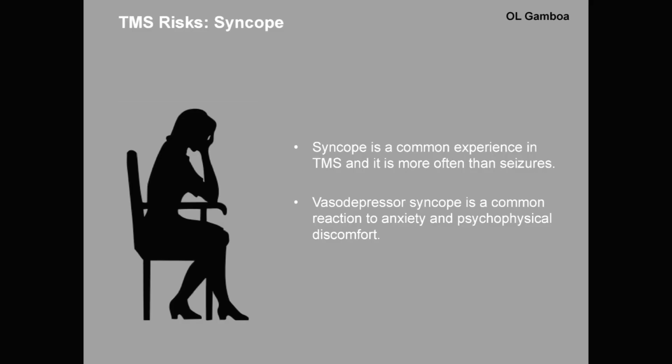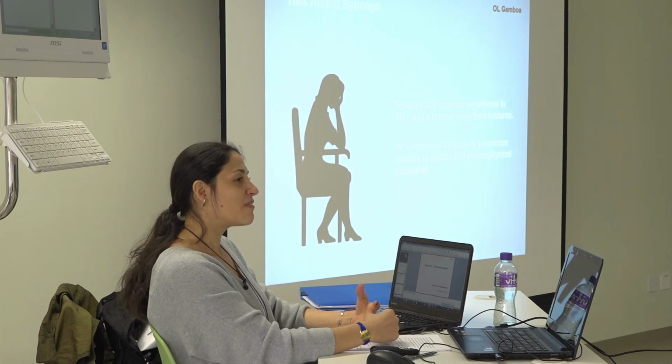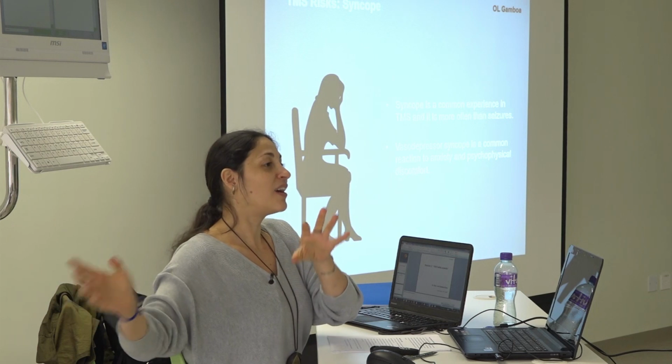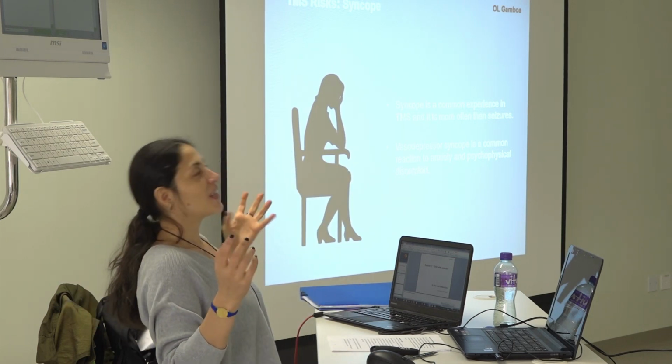Syncope. Okay. This has been my experience actually. No headaches, no migraine, no anything. I did have this experience mainly with boys. That's kind of interesting. I don't remember if I had it with any female, but mainly with boys. They are there waiting to be stimulated, and suddenly you feel that they are starting to faint or something like this. It's quite interesting.